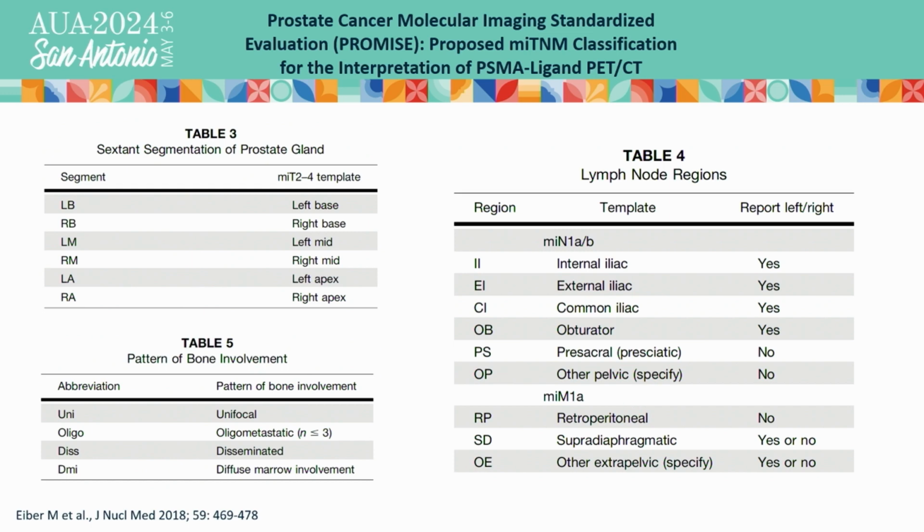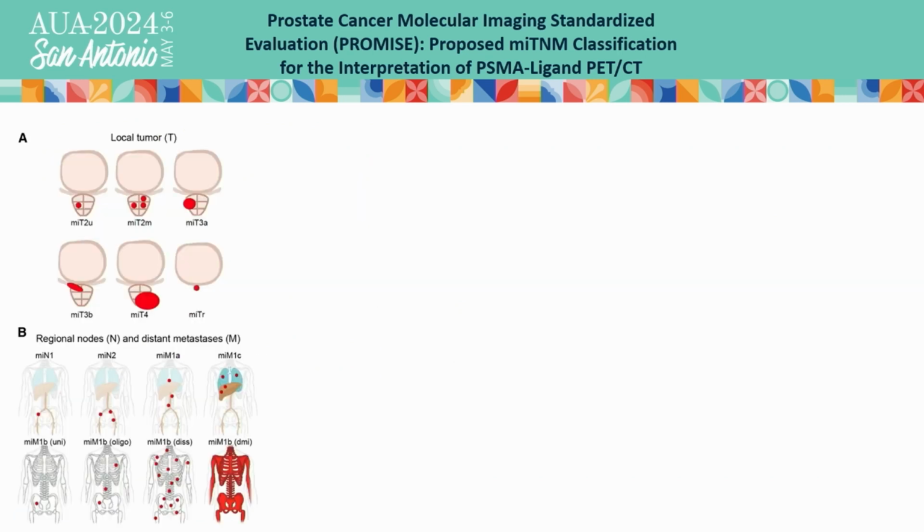Salvage radiation treatment, stereotactic radiation treatment, salvage lymphadenectomy, because a year ago we would receive a report telling us there is a lymph node around the iliac vessels. So it could be everywhere, from the common iliac to the internal iliac, the external iliac. With this type of classification system, you have the exact knowledge where these metastases might be located. And those are some examples.